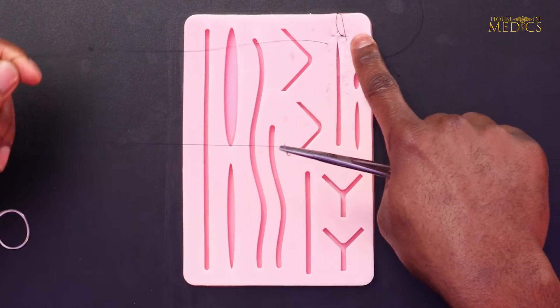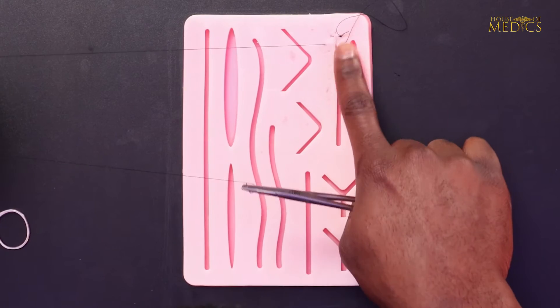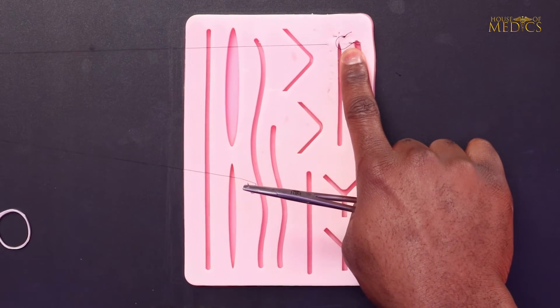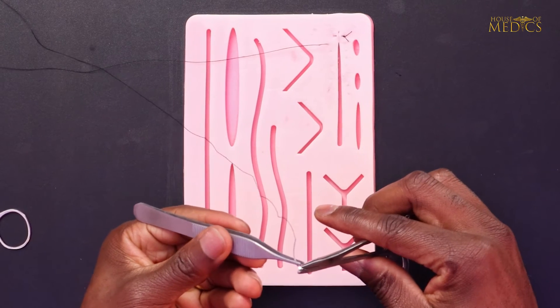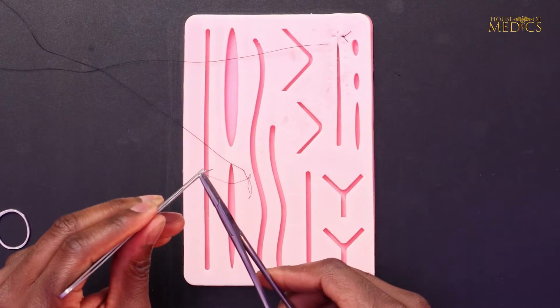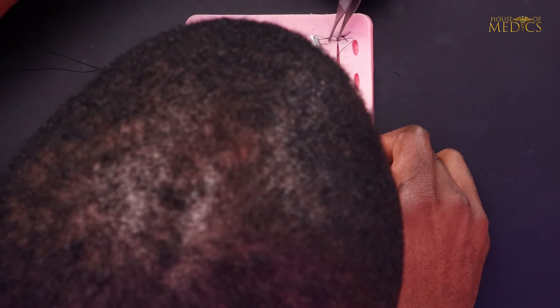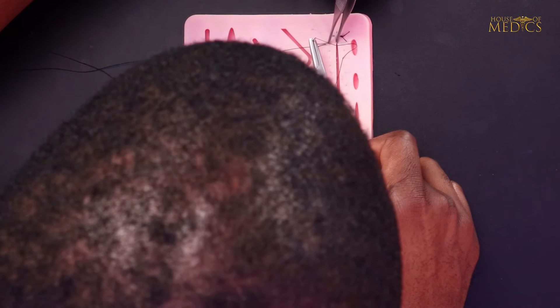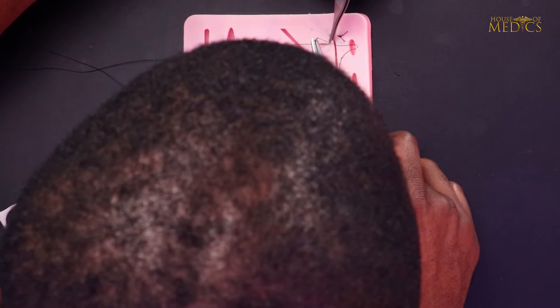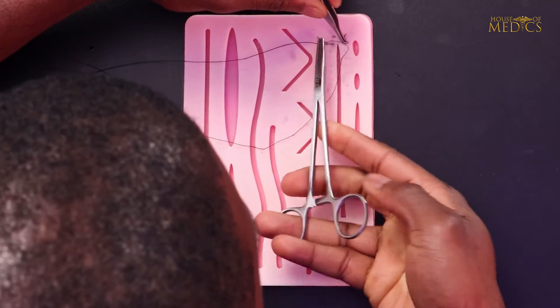As you can see, rather than simply cutting both sutures we have continued suturing to make sure that this is a running suture, unlike a simple interrupted vertical mattress suture. You mount your needle in the backhand fashion and then pass a near-near throw.